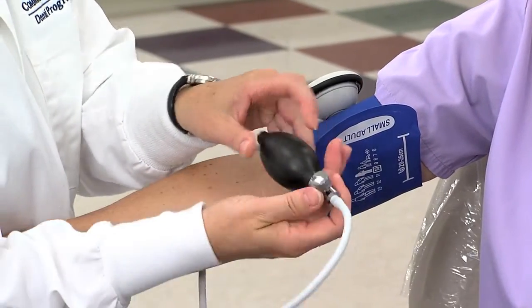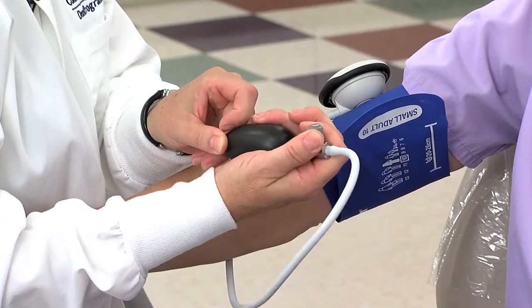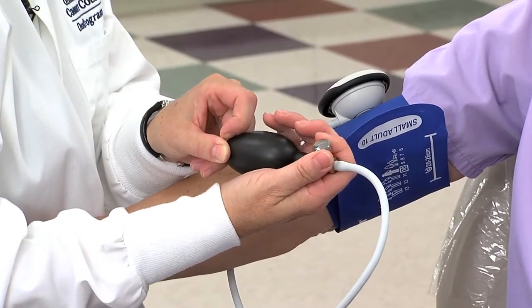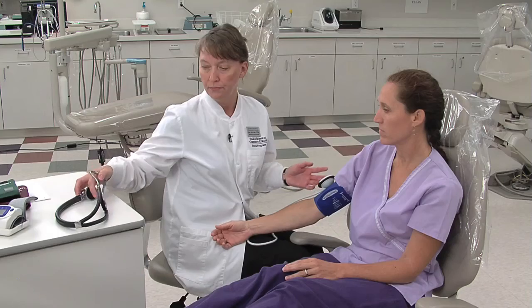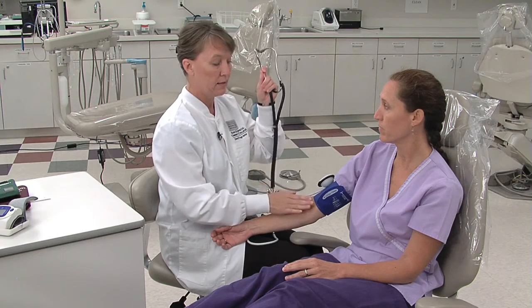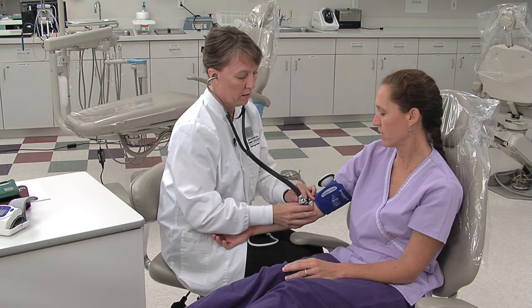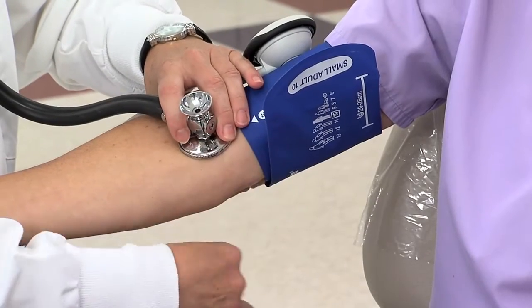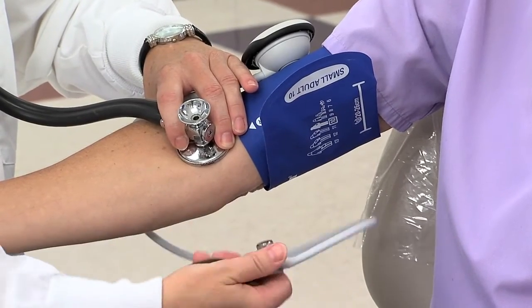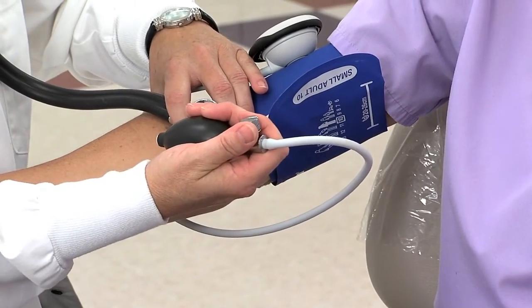The sphygmomanometer has a bulb on this end where you can tighten and loosen. To pump the cuff up, you want to make sure that this valve is closed. Turning it to your right will close the valve. Once this is in place, the patient can rest their arm. Then you want to take your stethoscope and place it in the antecubital area, making sure that you have your stethoscope correctly in the ears. Place the stethoscope directly over the brachial artery. With your right hand, or your dominant hand, you want to pump the cuff to the 108 reading that we got earlier.